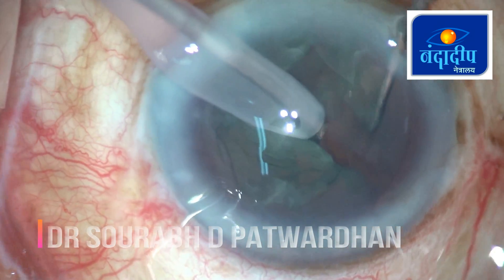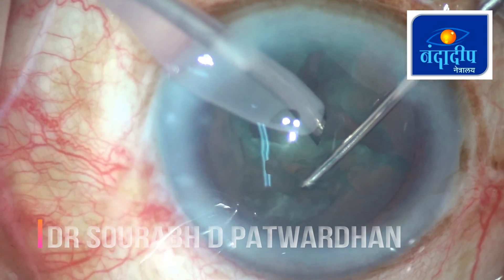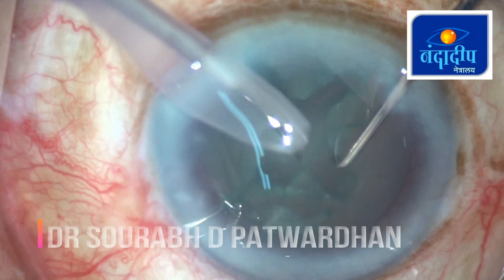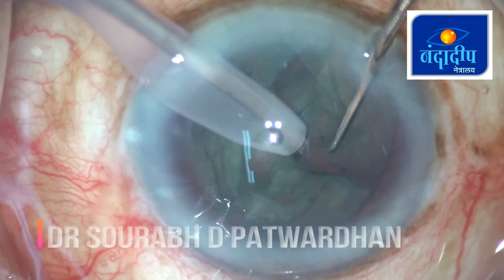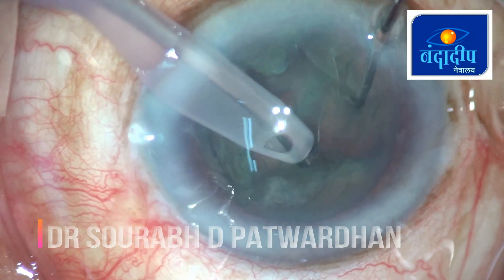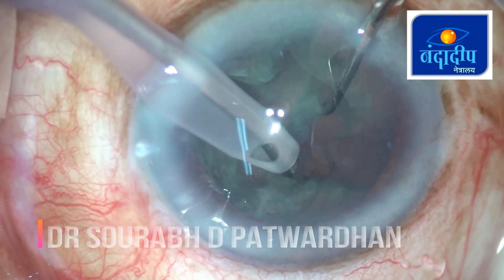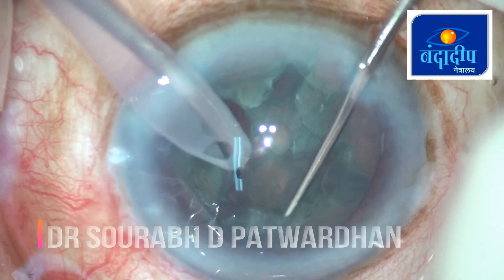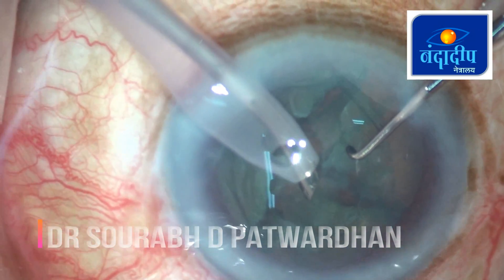There is no hurry at all. Another piece — good deep trench and the division is complete. These are the important maneuvers and steps in the surgery for a softer grade of cataract to avoid creating a bowl.